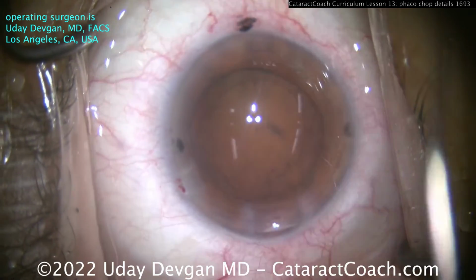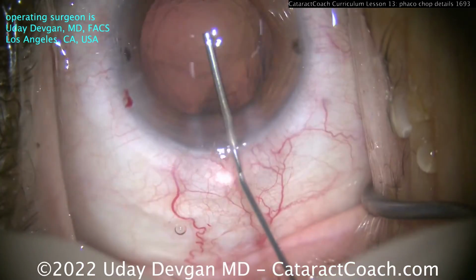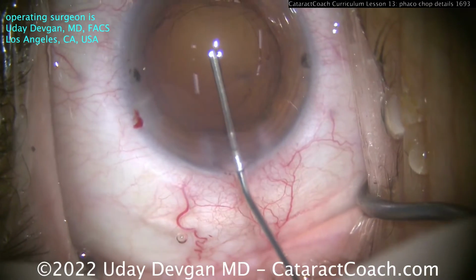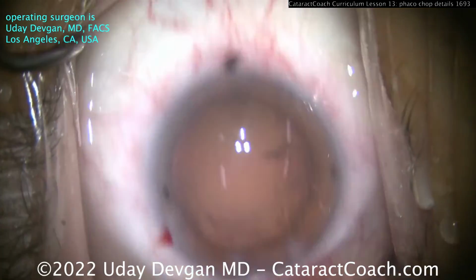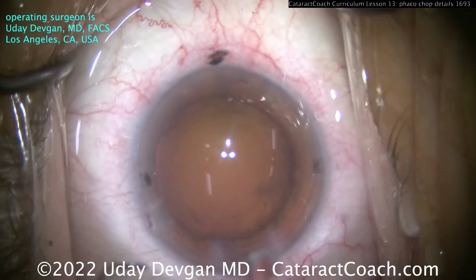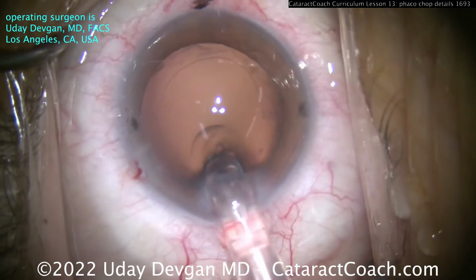And if you look carefully, there are already some marks on the cornea and the corneal epithelium that show us where we're going to line up this toric lens. And so delivering the lens is going to be our next step. Capsular bag is full of dispersive or cohesive viscoelastic. Here you go. Here comes that lens being delivered.